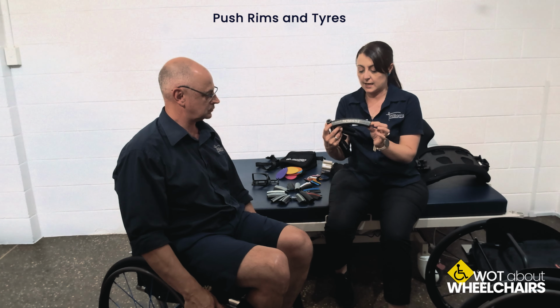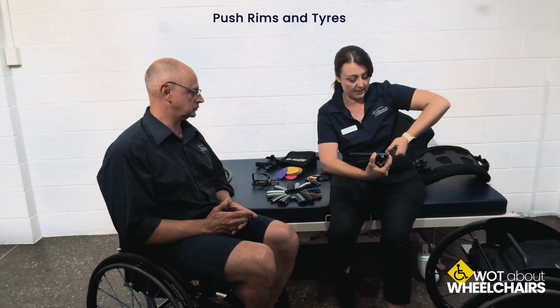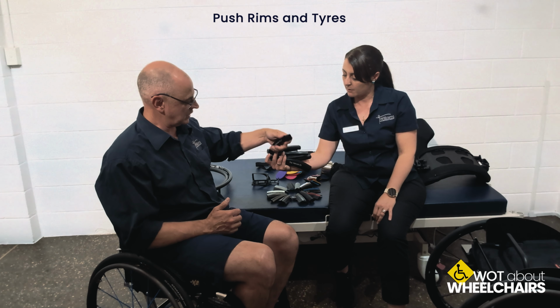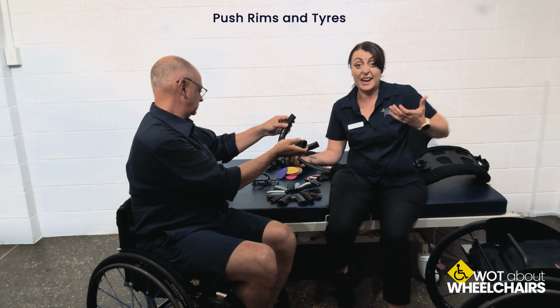But there are some other options, and I particularly like these. These are the natural fit, and they're actually more of an oval. It means that it kind of molds to the shape of your hand like this. They're a little bit easier to grip. If you want to try that one, much thicker. And that one there is even thicker. That one's even bigger again. So that again depends on hand size too.